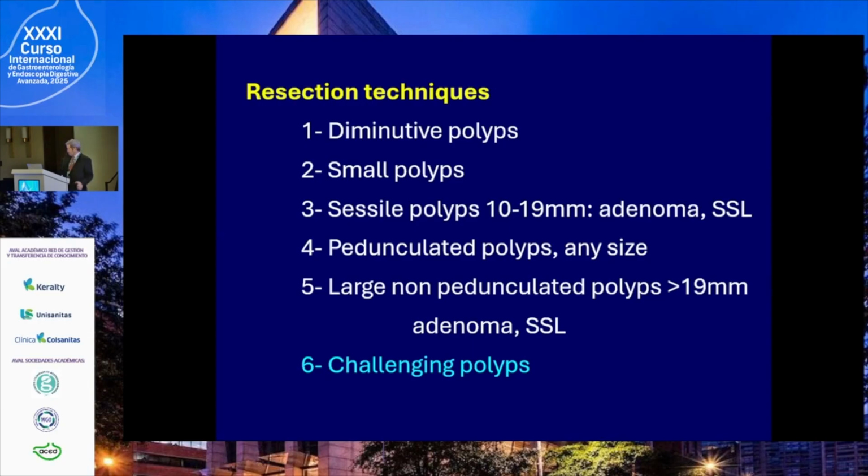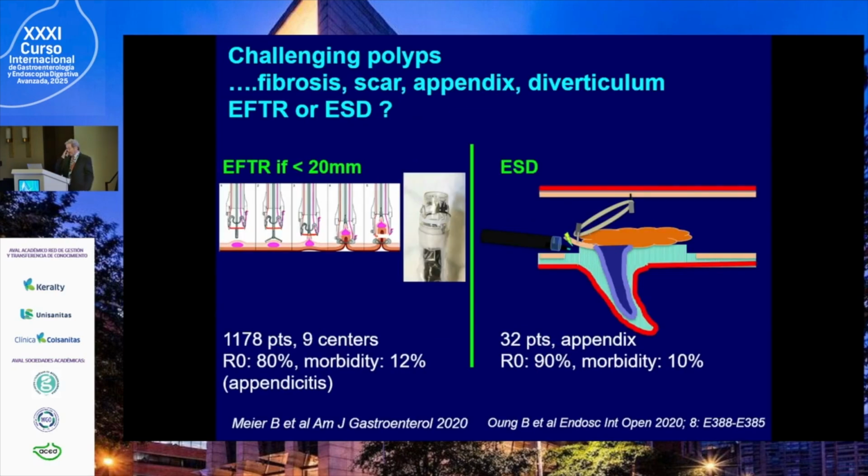Now, challenging polyps. I don't know how much time I have, maybe 20 minutes more. Okay, challenging polyps. I will show you the video. What does challenging polyps mean? Do you all agree with the previous slides? Okay? You all agree? Of course, I know that you probably perform piecemeal EMR. Okay, but now we do ESD. Except for lateral sessile serrated lesions, we still do piecemeal cold snare, okay? Except when there is a dysplastic area. This is the main message, okay?